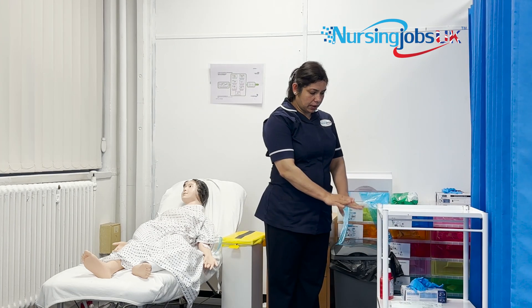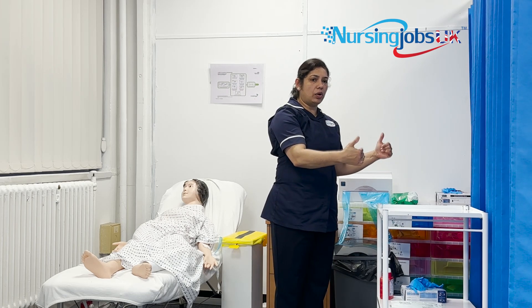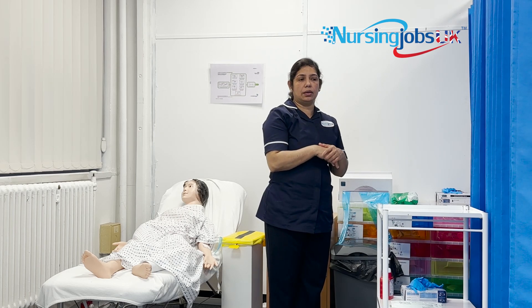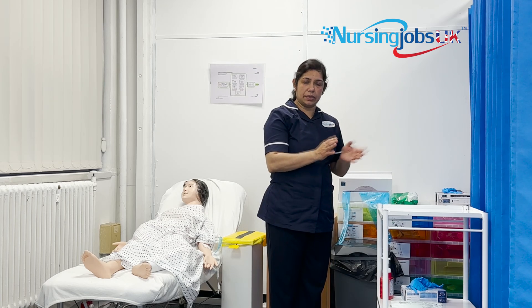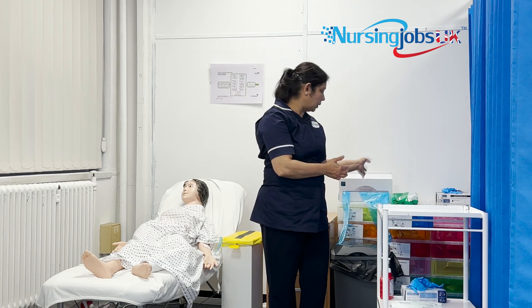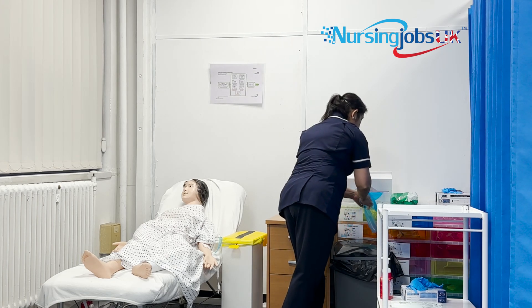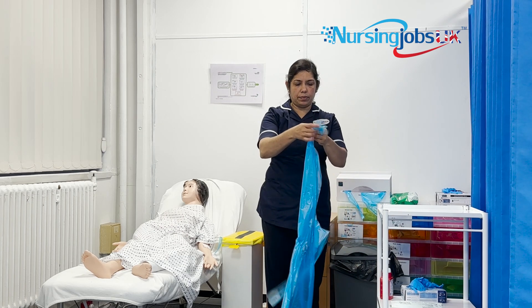All your equipment is on the bottom trolley. If you're arranging from outside the curtain, always make sure you either keep a spare apron on the trolley or wear the apron before entering. Come in with minimal disturbance to the curtain. Since I'm near the patient, I'll wear the apron from here. Otherwise, you can wear the apron once you reach the patient's side.